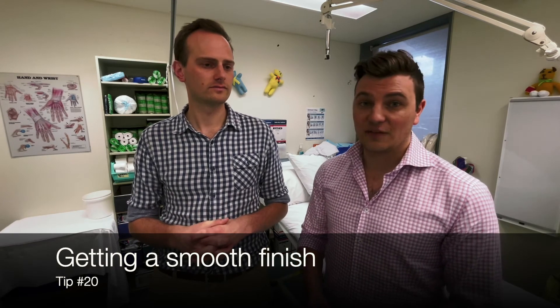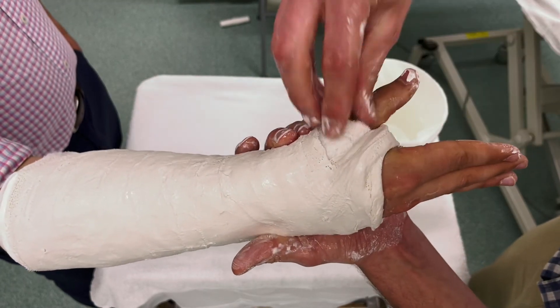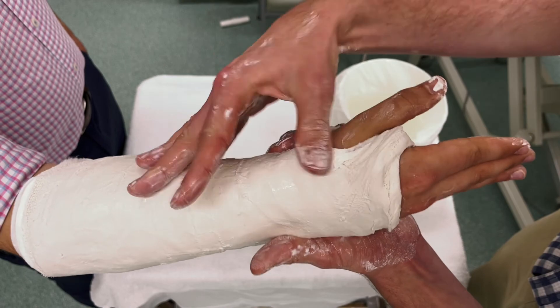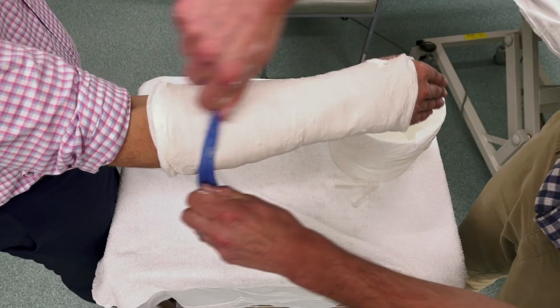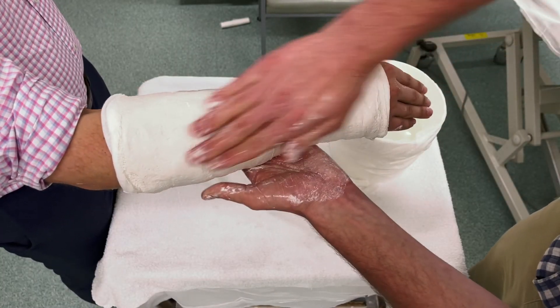For finishing touches, smooth the edges of the cast with wet, plastered fingers to create a nice smooth contour that doesn't dig into the patient. You can also run a glove up and down the cast to smooth it further and give it a shiny finish. Adding more water to your hands and doing flat-hand molding at the end helps keep everything together and removes excess plaster.